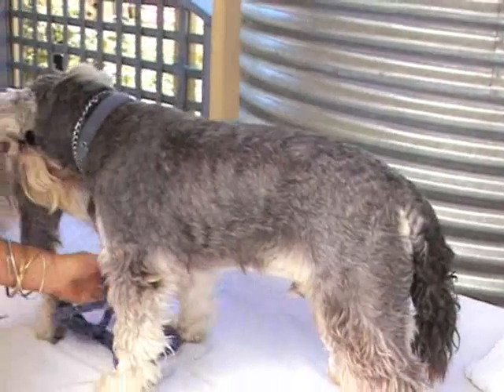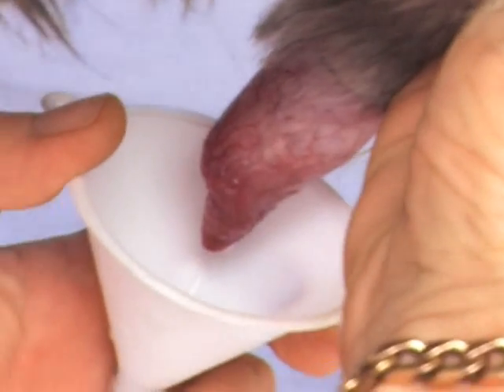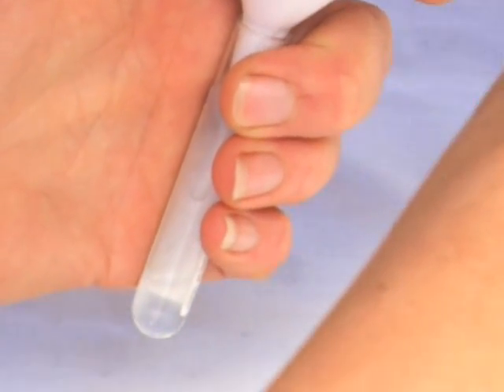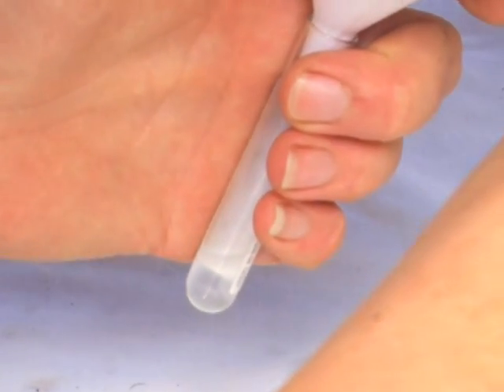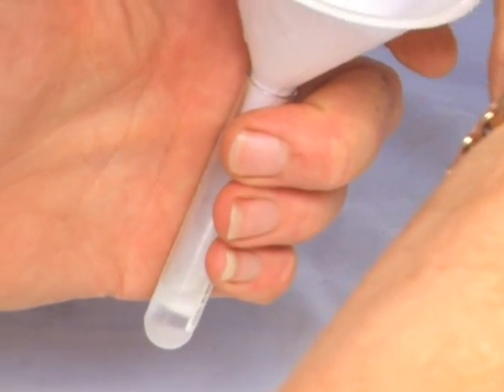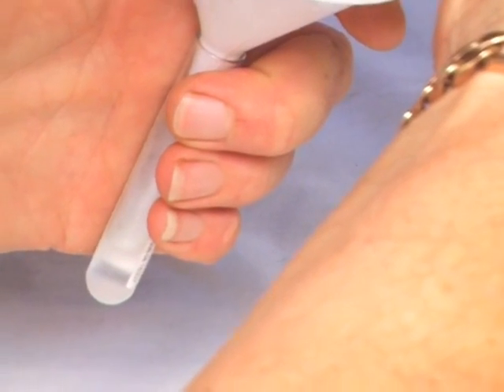Now we're going to collect Shadow — he's used to this procedure. The first fraction that comes out is clear, and that's like a pre-ejaculate. You can see the bottom of the test tube, it's fairly clear. And then after a little while, you can see it's starting to come out a little bit cloudy now, a little bit milky. You can see milky drops falling down to the bottom of the test tube — that's actually the sperm-rich fraction of the semen.